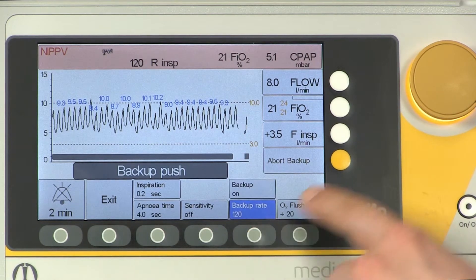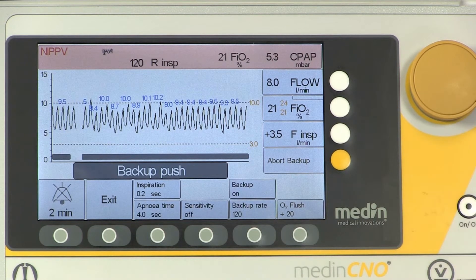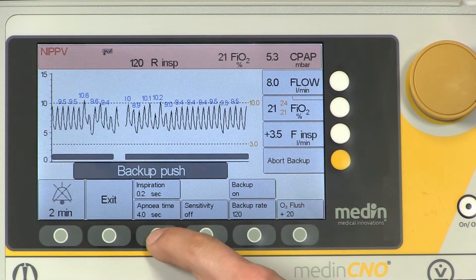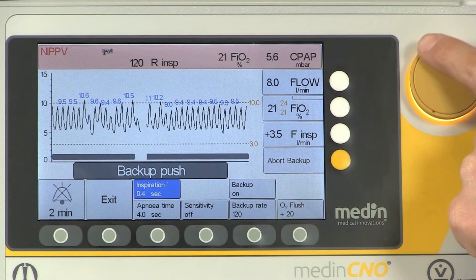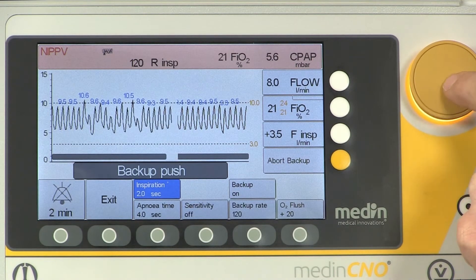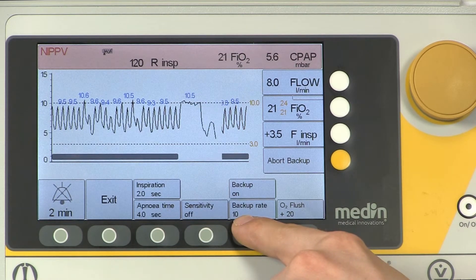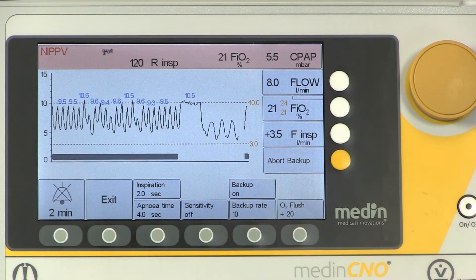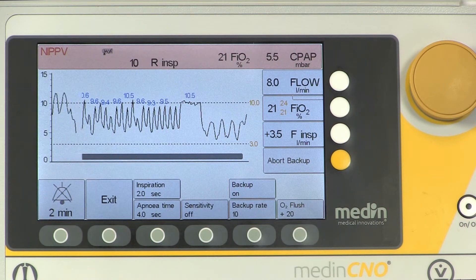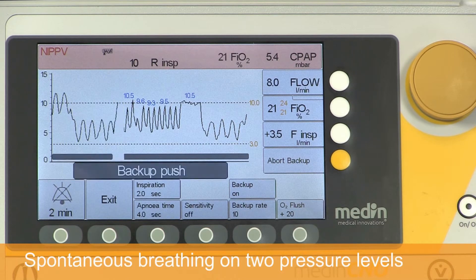The backup rate of a maximum 120 breaths per minute is limited by the inspiratory time. The non-invasive positive pressure ventilation enables the baby to breathe spontaneously with two pressure levels.